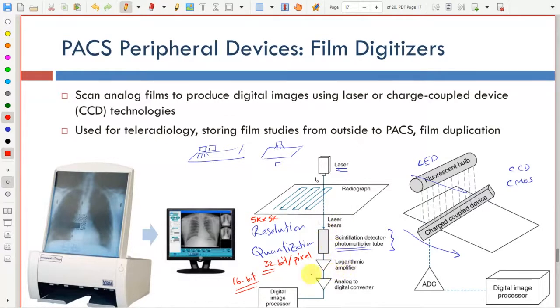If you want to put it in a 16-bit image, for example, you have to have some kind of dynamic range compression. Dynamic range compression takes a very high dynamic range, like 100 decibels, for example, and compresses it into something a little bit less. It does that in a way that doesn't lose the low echoes.